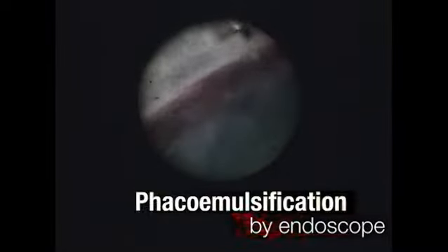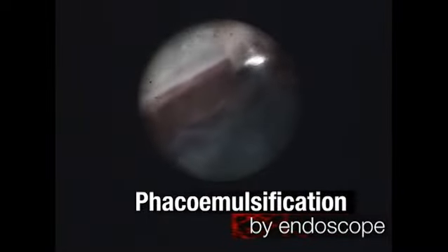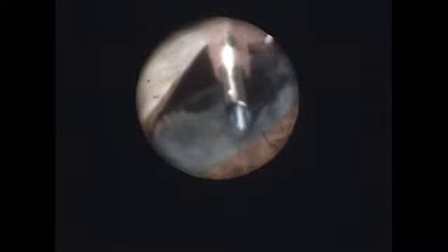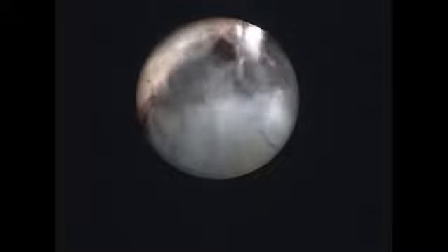Observing the phacoemulsification probe from the front using an endoscope has proven most revealing. In an initial phase, the pointer is positioned downward to concentrate the ultrasound and remove the cortex, so a groove can be made while being monitored by the endoscope. We can evaluate placement of the probe in relation to the cornea, the cataract, the capsulorhexis and the posterior capsule during fragmentation of the nucleus and also during removal of fragments.